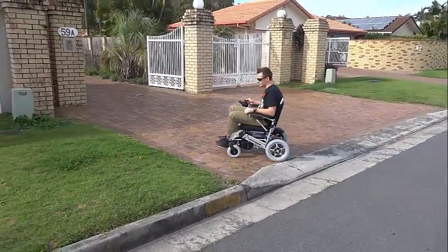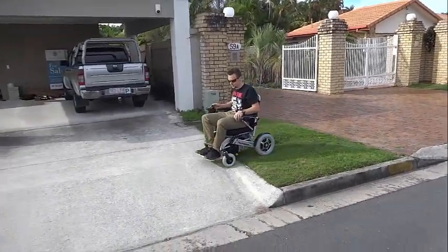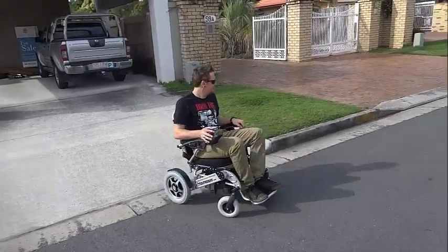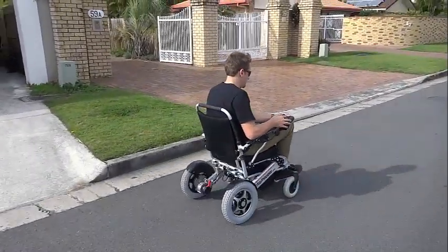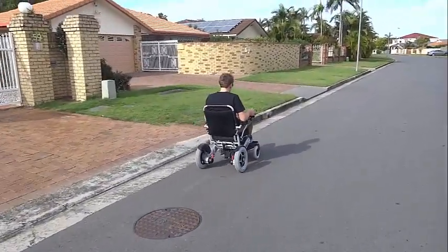The larger wheels also allow for reversing over obstacles that are too high for the front casters. Other than the larger wheels, the Super Grand is almost identical to the PortaShopper Grand, with the same specs and dimensions, except for the ability to carry heavier loads.